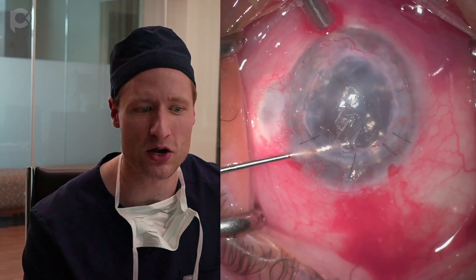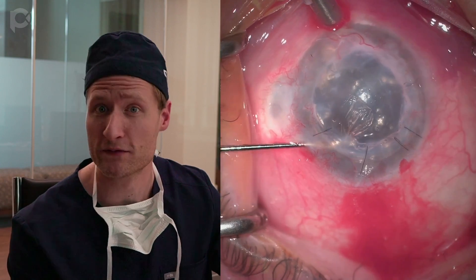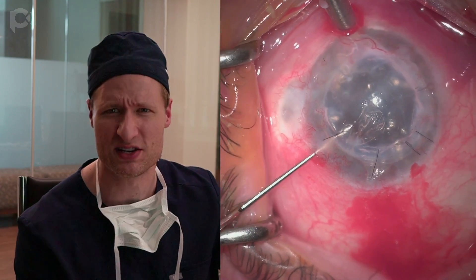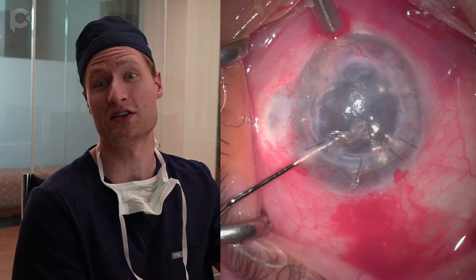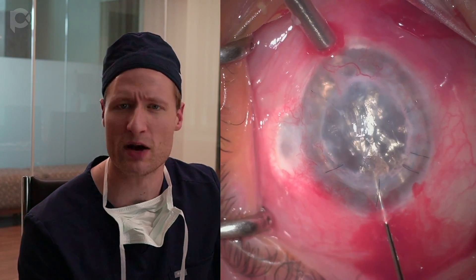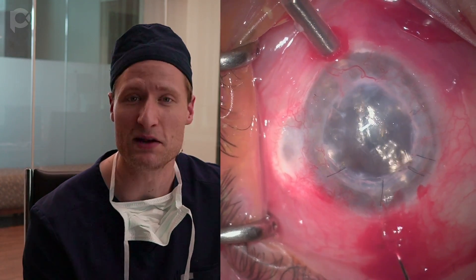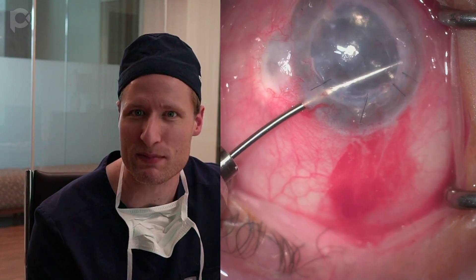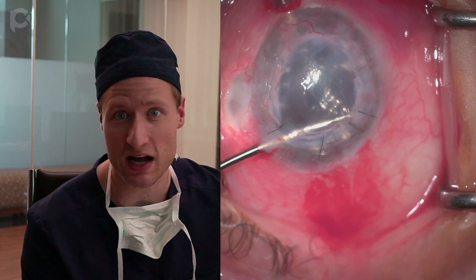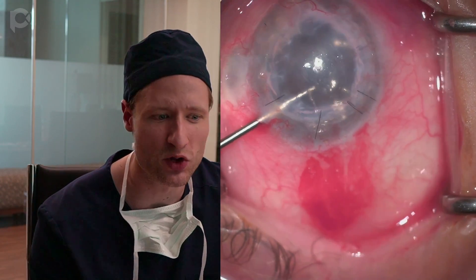Leaving these remnants will definitely interfere with attachment of the DMEK graft. In my experience, DMEK grafts attach better when the indication is bullous keratopathy than for Fuchs dystrophy — which is counterintuitive and paradoxical. Why would the graft attach better in a sick eye than a relatively healthy eye? I don't have the answer, but if you're having trouble with DMEK graft attachment in these eyes, it may be because you have remnants of Descemet's membrane left behind. So I spend most of this surgery removing those remnants.